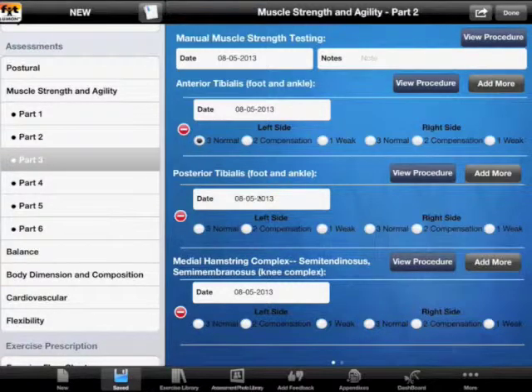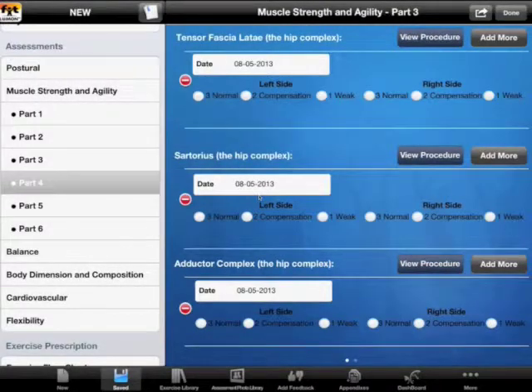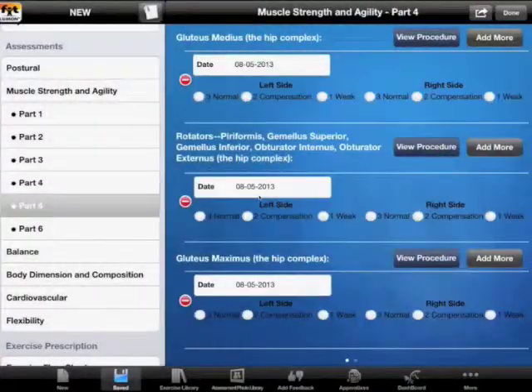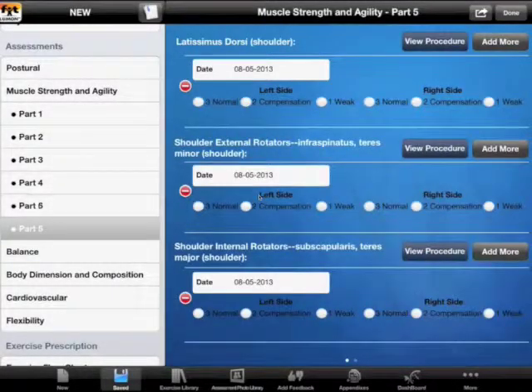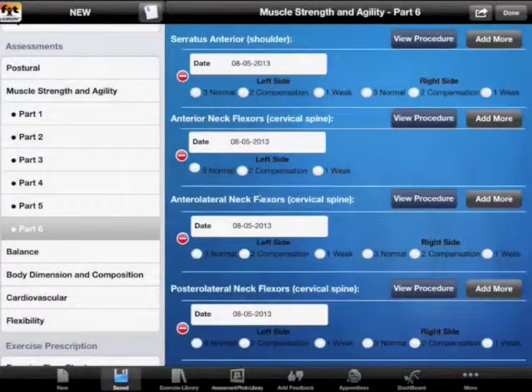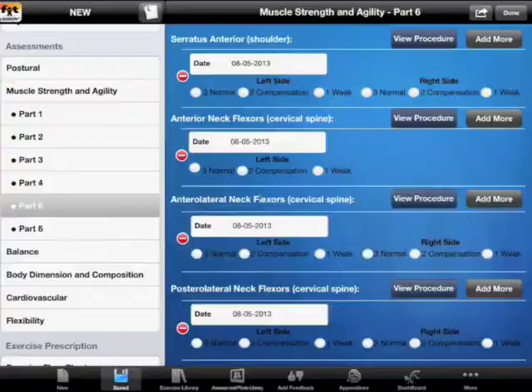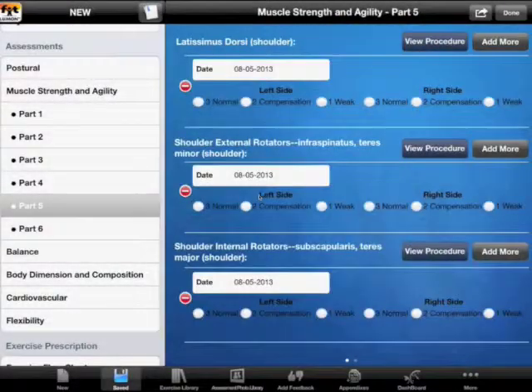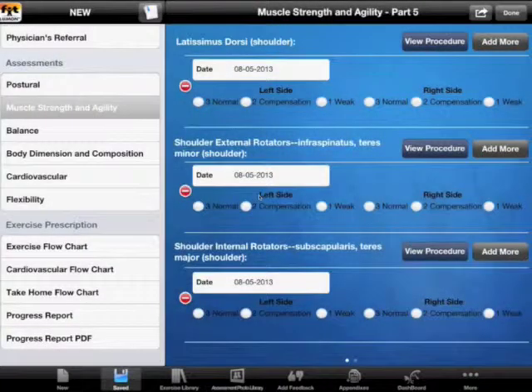Parts three, four, five, and six will have more and more muscles that you can test. And this concludes the muscle strength and agility section.